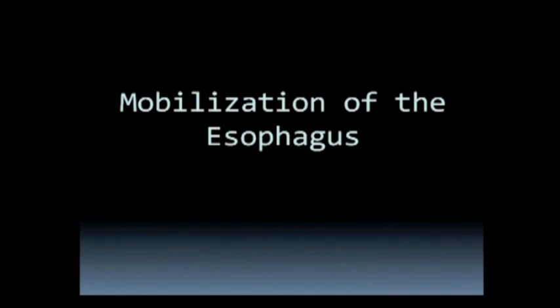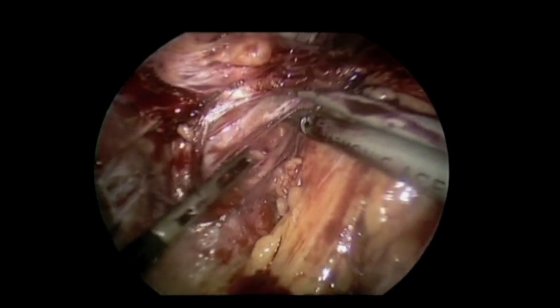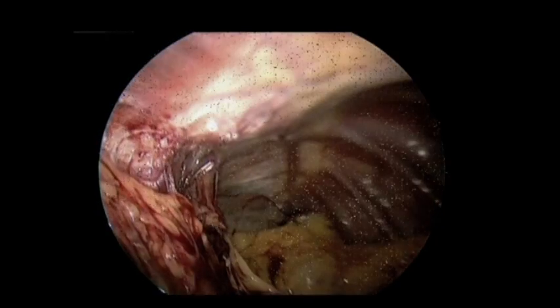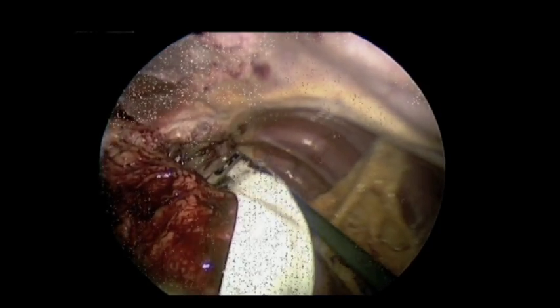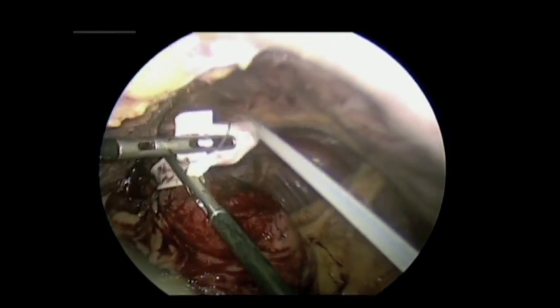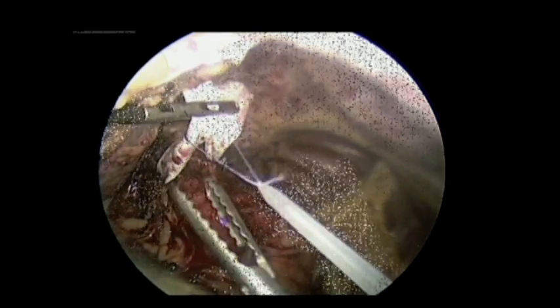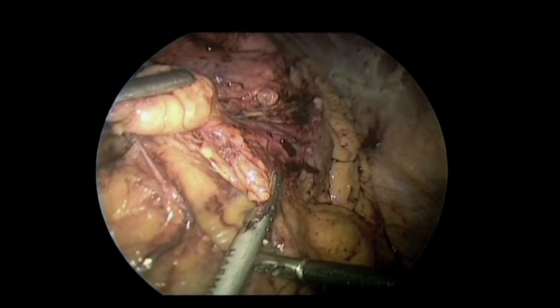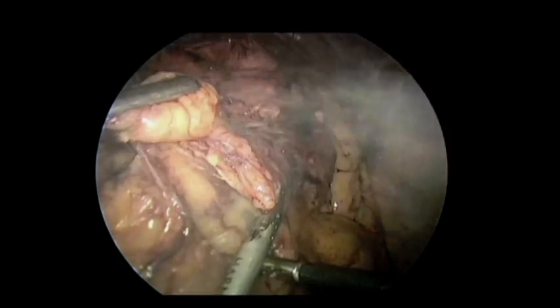Once the adhesiolysis was done, we identified our left and right limbs of the crura, created a retrogastric or retroesophageal tunnel, and circled the GE junction with a Penrose drain. This was used for atraumatic handling of the tissue. We then went back down, identified our gastric remnant, and started mobilizing laterally.